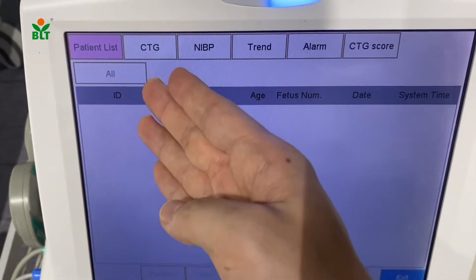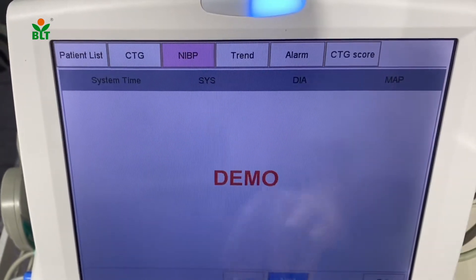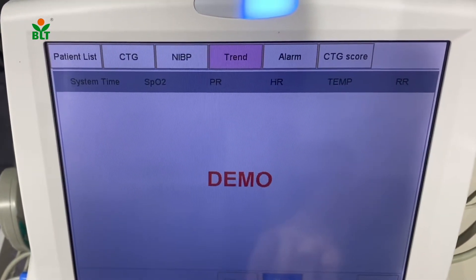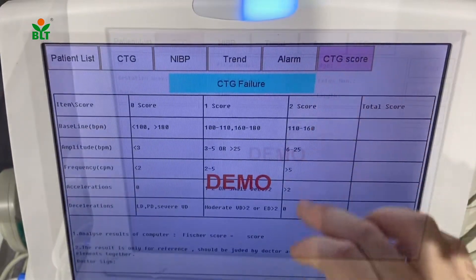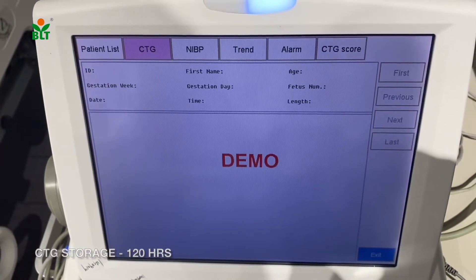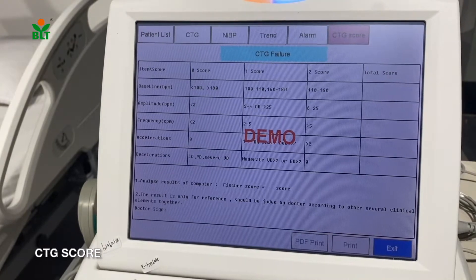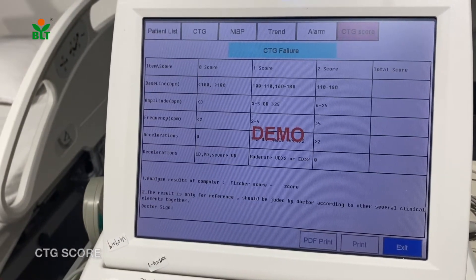In this function, you will be able to see the patient list, CTG waveforms, NIBP, trend data, alarm events, and CTG score. For CTG storage, we can support up to 120 hours. Our professional CTG analysis system provides reliable reference for clinicians.